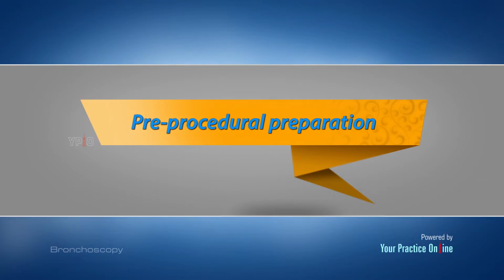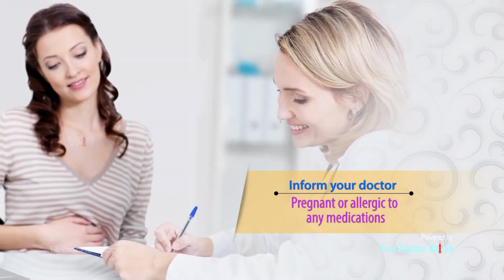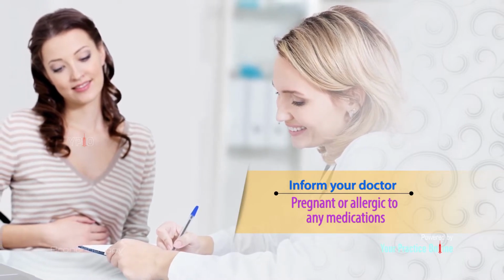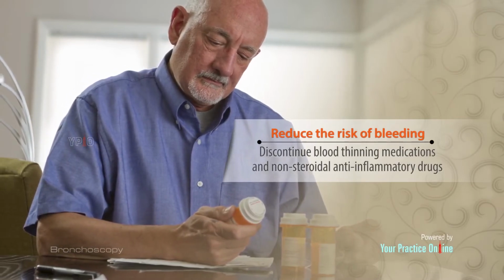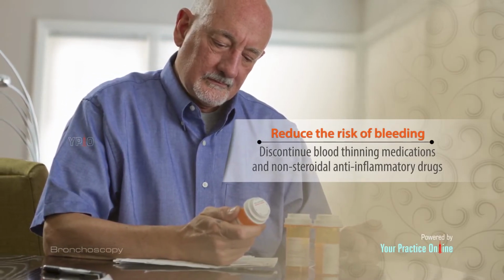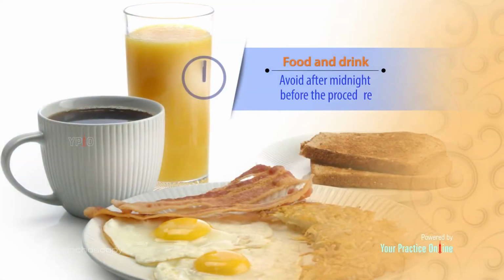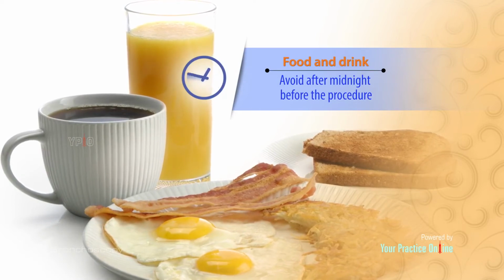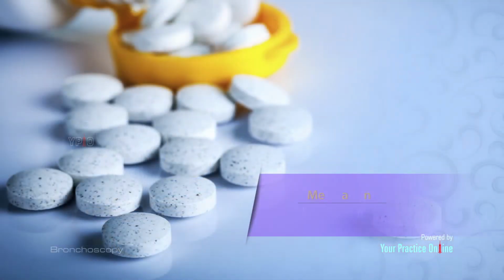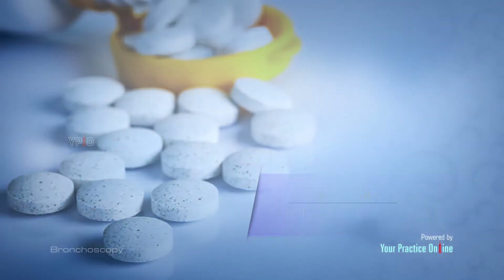Pre-procedural preparation. Inform your doctor if you are pregnant or allergic to any medications. Other tests may also be ordered prior to the procedure. To reduce the risk of bleeding, you will have to discontinue taking blood-thinning medications and non-steroidal anti-inflammatory drugs a few days before the procedure. You should abstain from food and drink after midnight before the procedure, and if instructed to take medications, you should do so only with a sip of water.